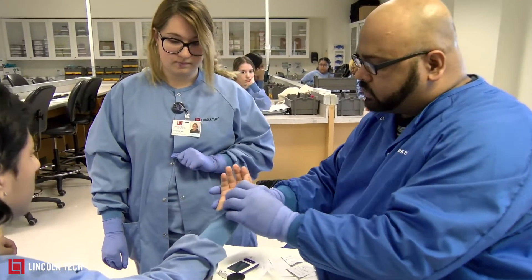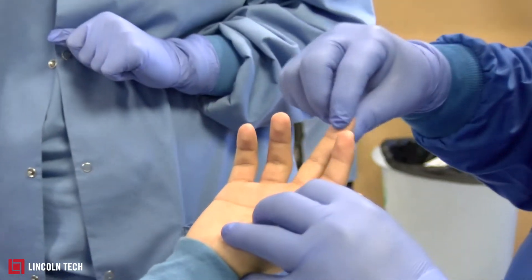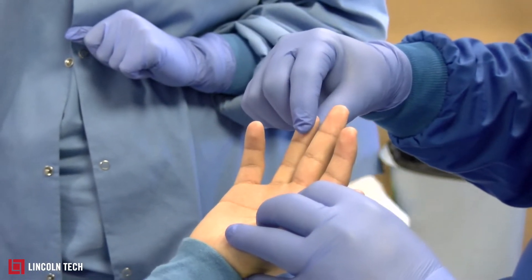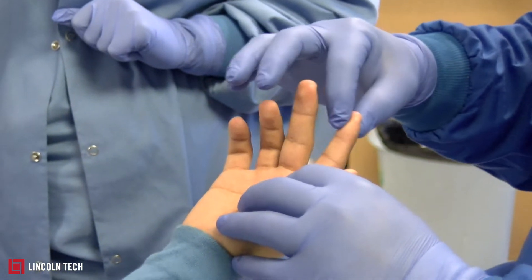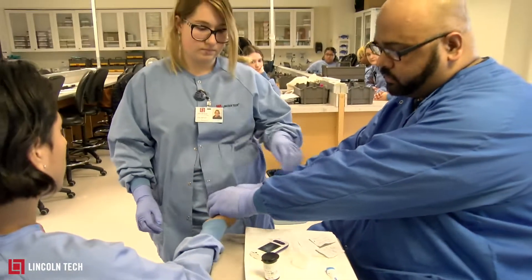When you're doing a glucose stick, it's very important which fingers you use. Your first preference is always the middle finger, and your second preference is the ring finger. So we're going to use these two fingers.